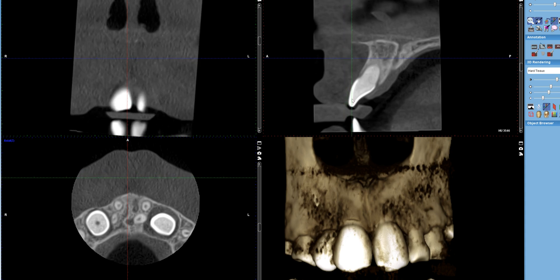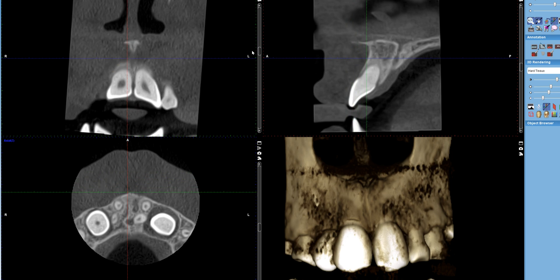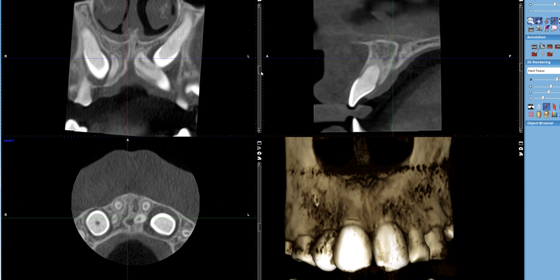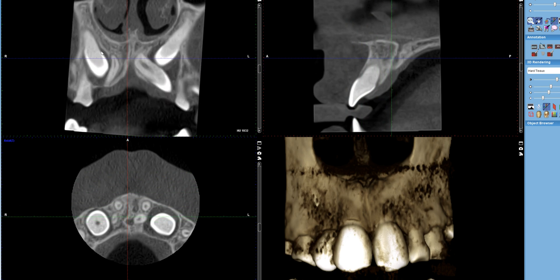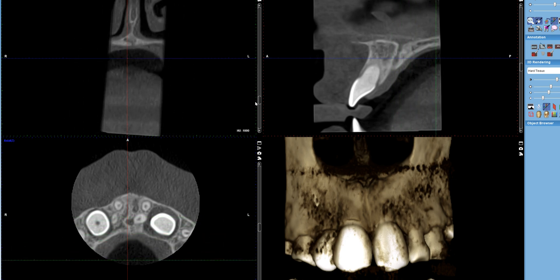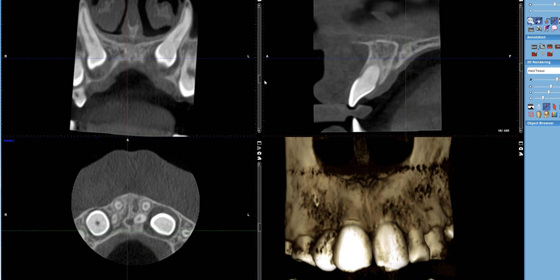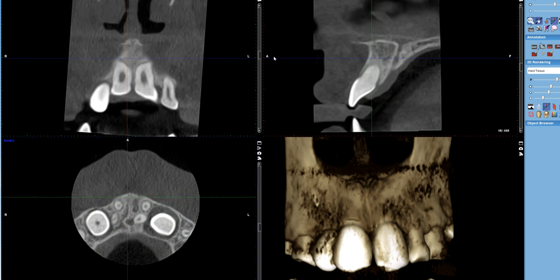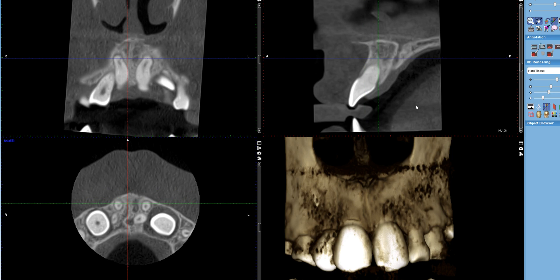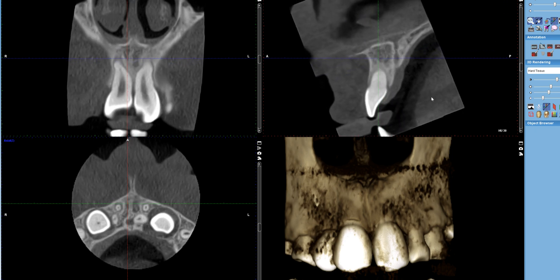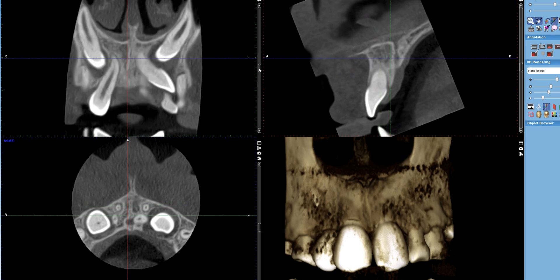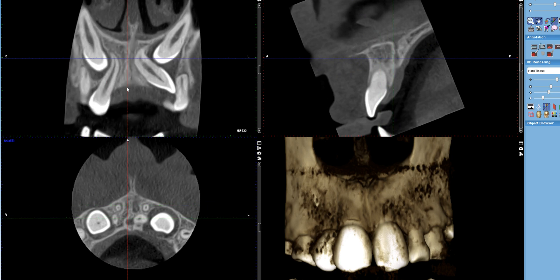Moving posteriorly, we're starting to capture the enamel layer of the central incisors right here. Here we have the centrals, and we have the lateral and canine. Let me go back one more time — canine, lateral, and centrals. To make this view a little bit easier for you to interpret, I'm going to rotate it so that we're seeing the more anatomical length of the central incisors, and we can see the canine and laterals a little bit better.